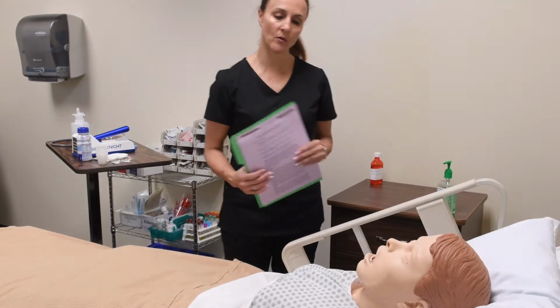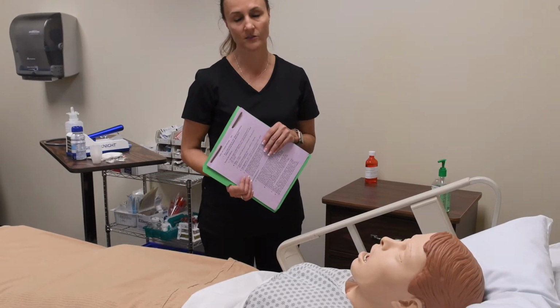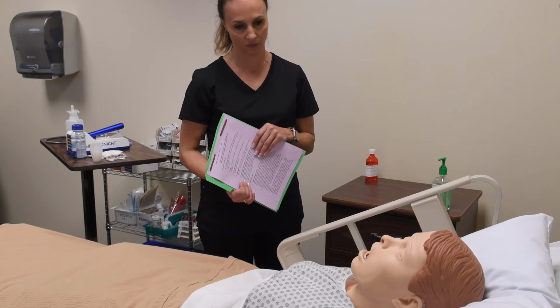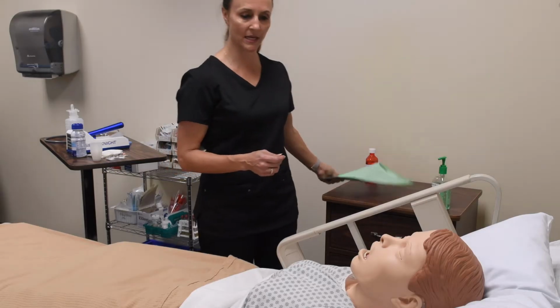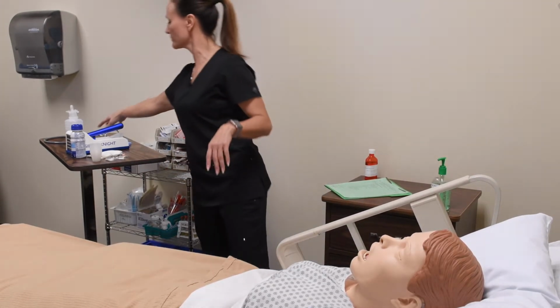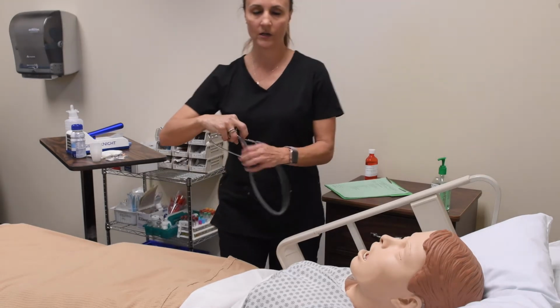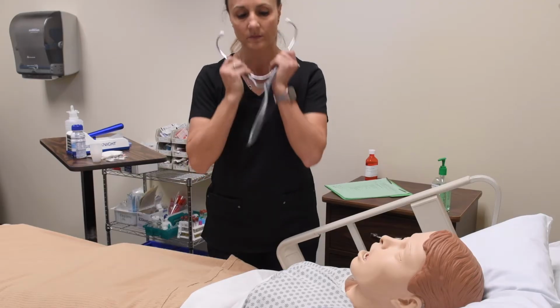Ms. Jones, what we're going to do today is the doctor has ordered some enteral feedings and also some medications that I need to give to you this morning. Is that okay with you? Okay. Before we begin, I also need to make sure that I provided for privacy. I want to go ahead and make sure that I am assessing my patient's lungs and their bowel sounds.